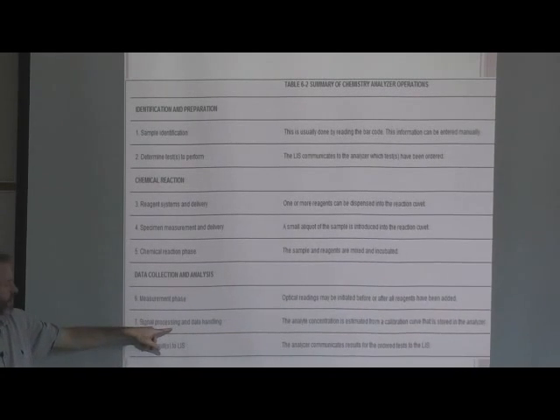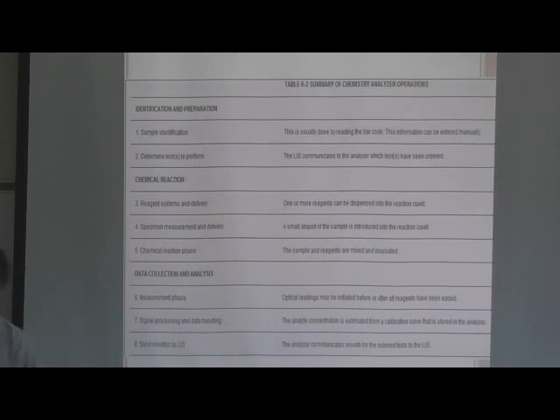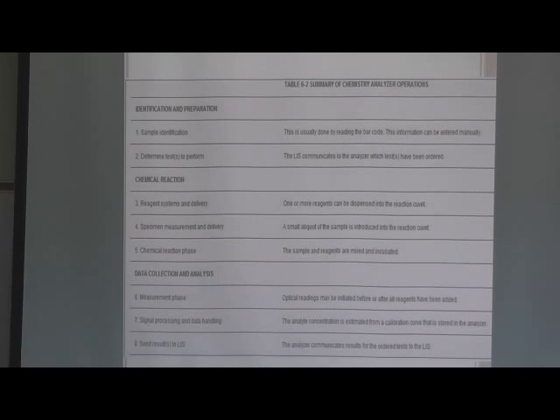The signal obtained from that optical reading will correlate to the calibration curve that was set up on the machine, right? And that's where we get the 10x rule violation. If the calibration was bad, you could have it shifted.